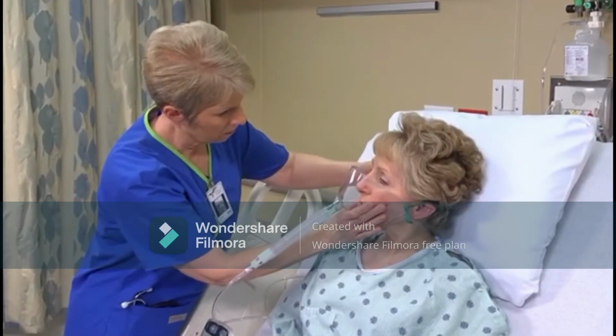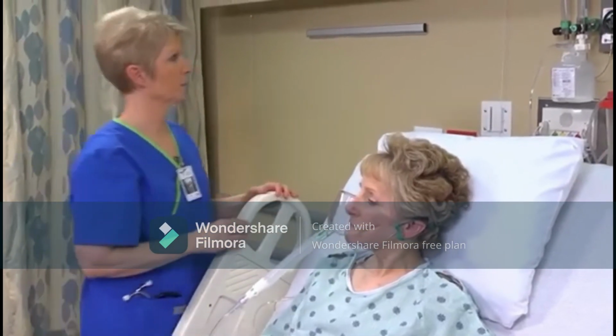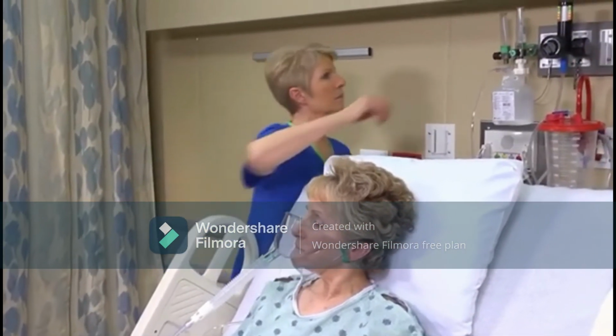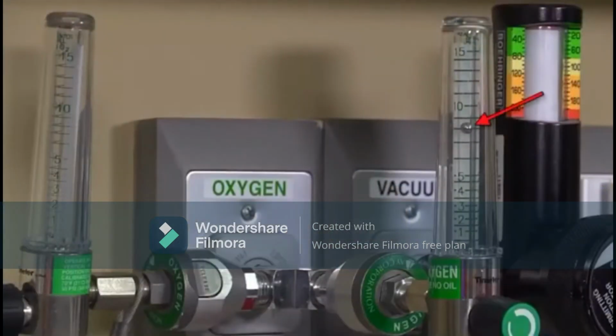For all methods of oxygen delivery, confirm that the oxygen source and flow meter have been set up properly and calibrated to deliver oxygen at the prescribed rate. Ensure that the ball on the flow meter is even with the number of liters per minute ordered.